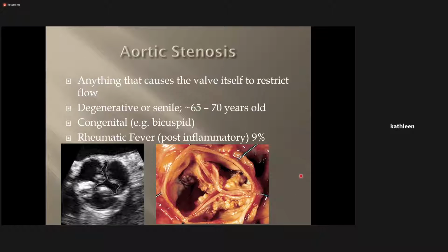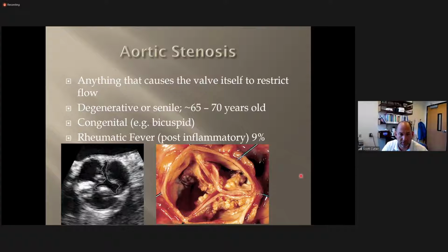So that's all calcification, none of that is vegetation or anything? Correct, this is typically a calcification. Vegetations are going to hang off the valve and dangle out into the fluid, flipping back and forth. These are attached to the valve. They're rigid in what they are.